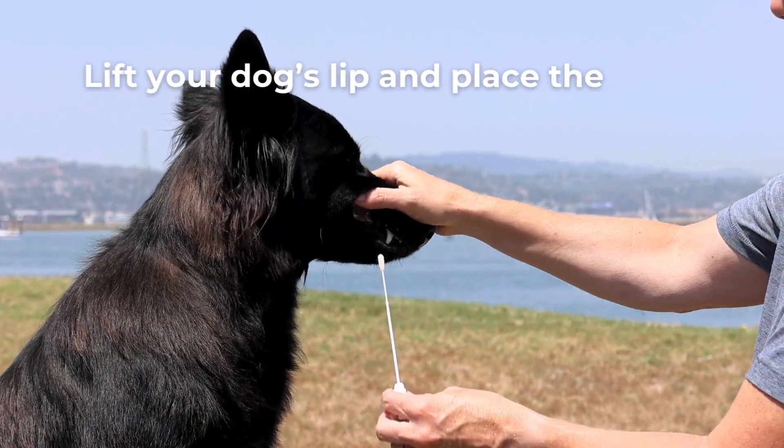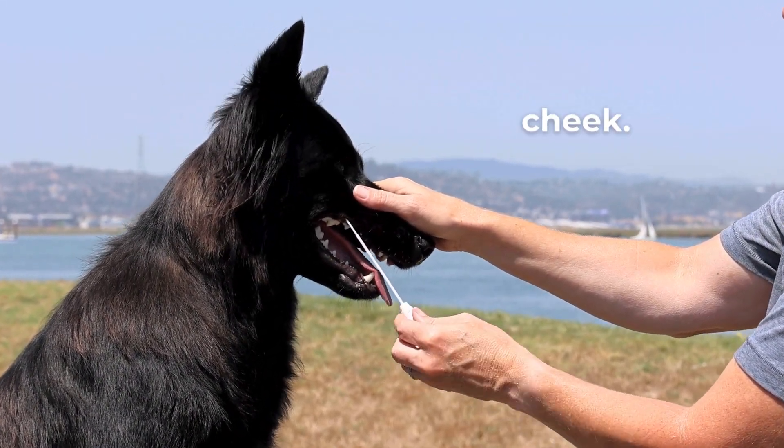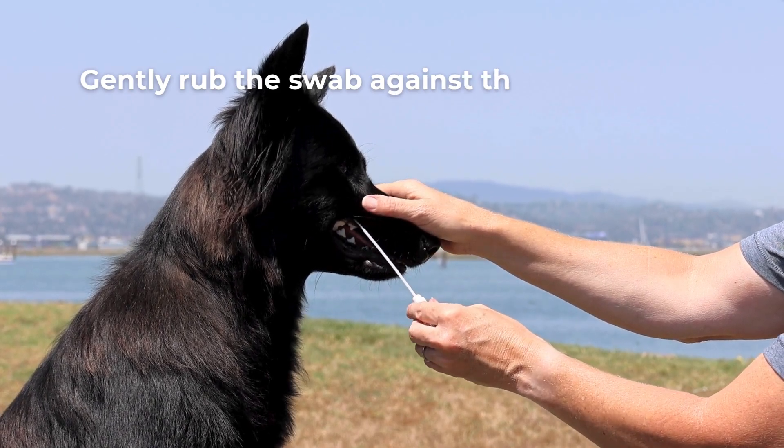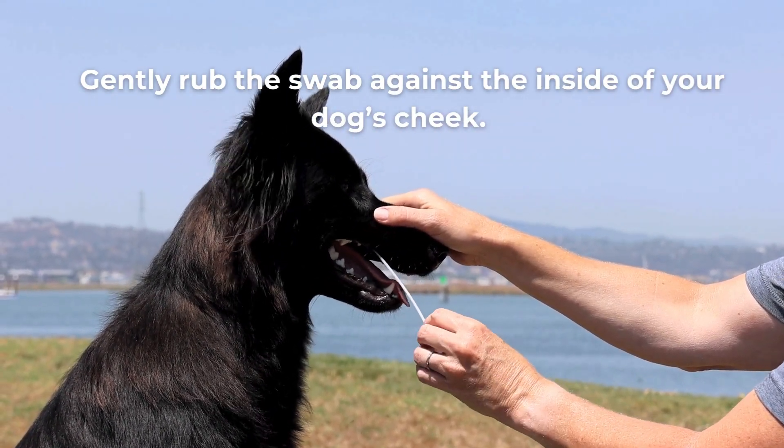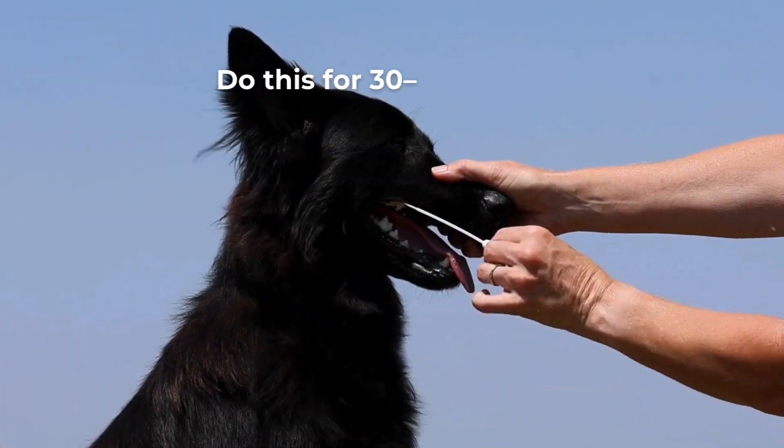Lift your dog's lip and place the swab between the gum and cheek. Gently rub the swab against the inside of your dog's cheek. Do this for 30 to 60 seconds.